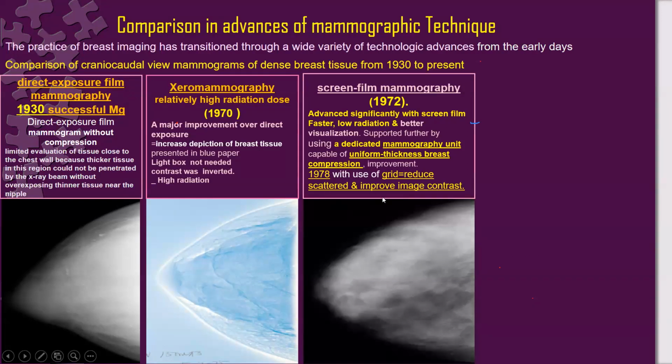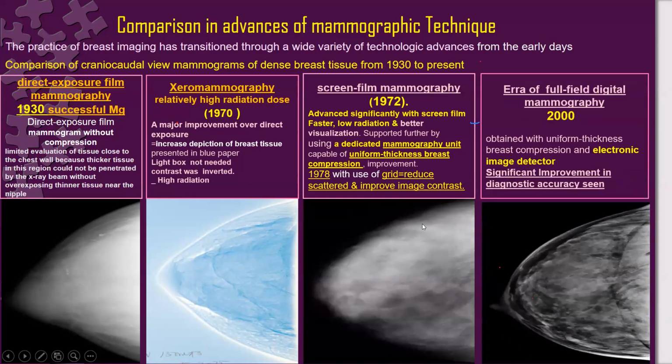and further improved when they started to use the grid system, up to the era of full field digital mammography in 2000.